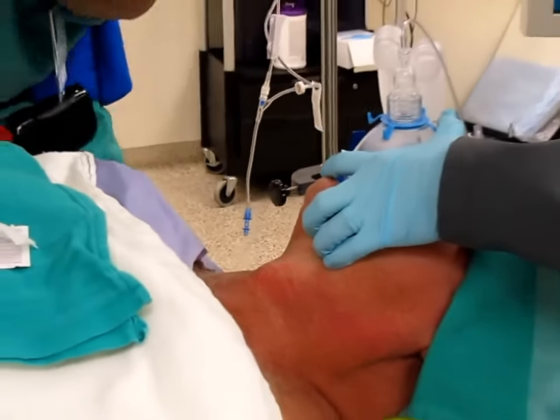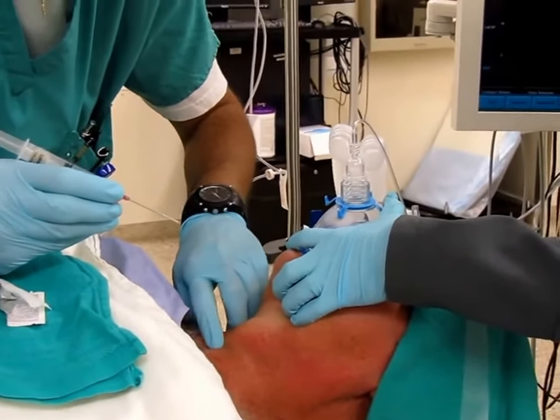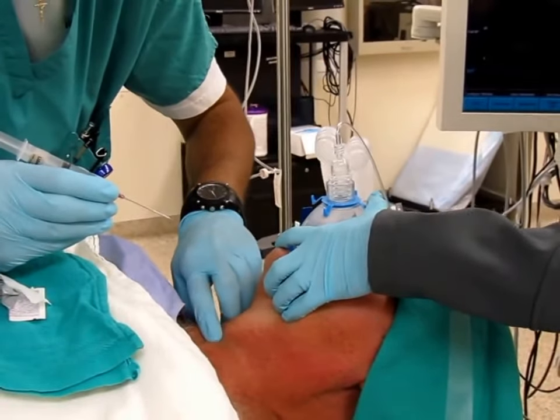Level up. Right after you get through the skin, you want to exert negative pressure on the syringe.